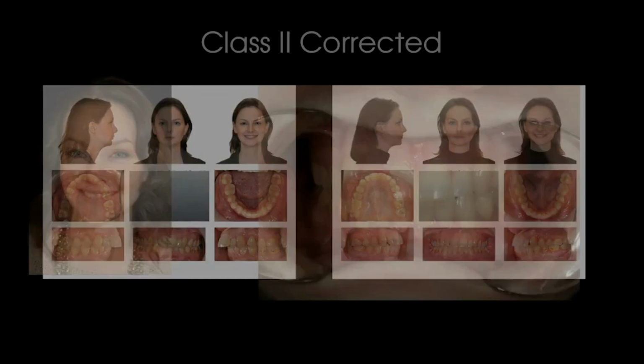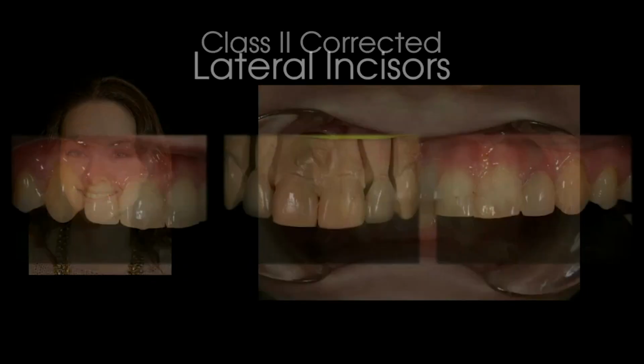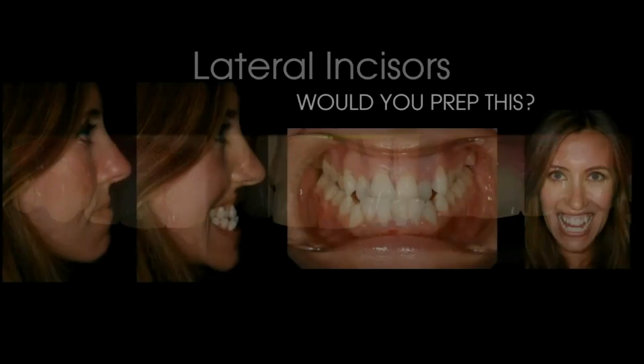And so here with the class 2 corrected, it was easy. All she didn't like was the smaller lateral incisors, and we're able to put that together as well and give her a nice result.